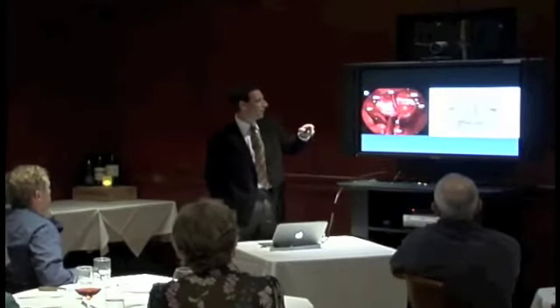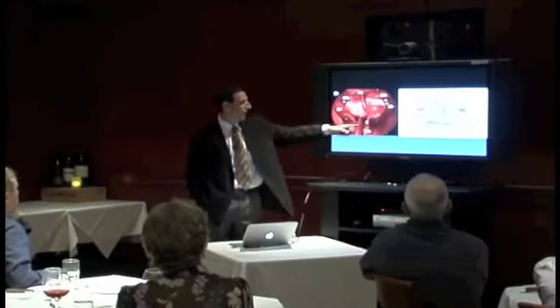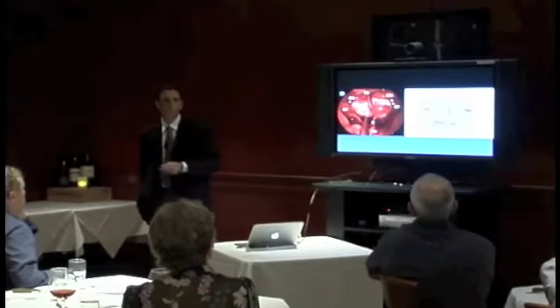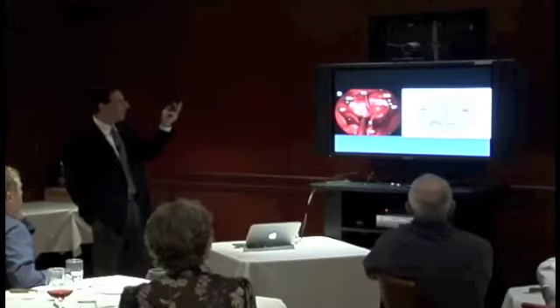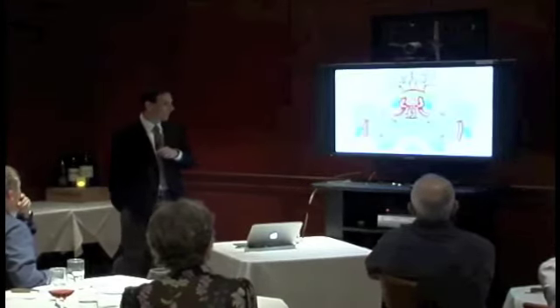So now we're looking at the anterior cranial fossa. Here are the carotid arteries and the cavernous sinuses. Here's the clivus. Here's the rostrum. And if we open this up and go further down, we're going to be towards foramen magnum and jugular foramen. So we now basically have a good start to approach any area of the skull base.